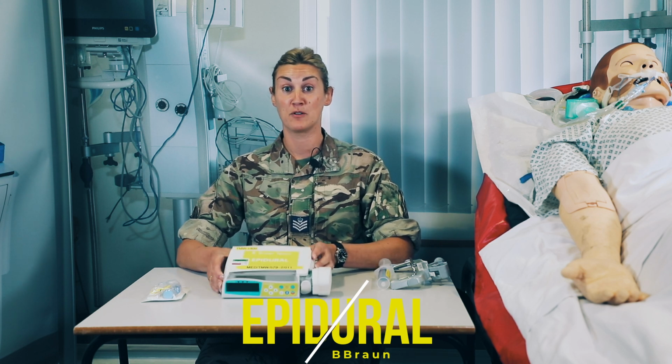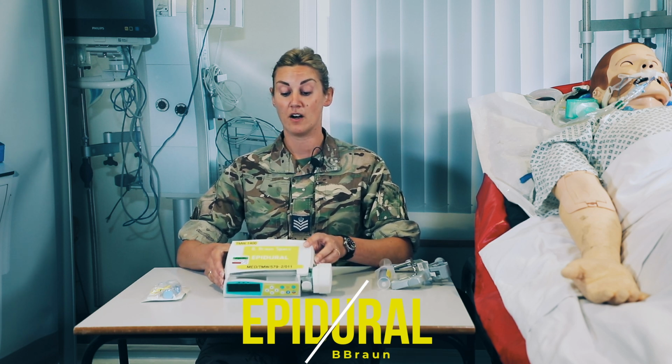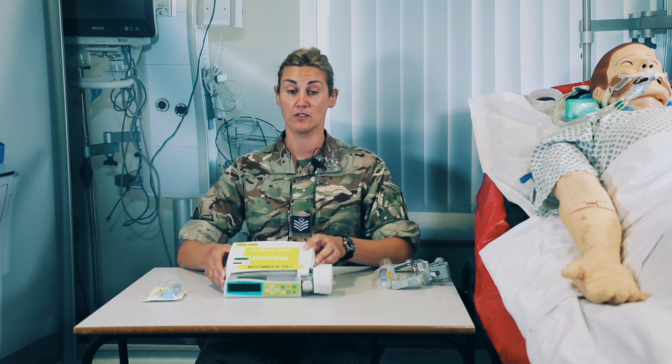Welcome to this epidural lesson. We are going to go through the functions and the operations of the epidural for use within CCAST.